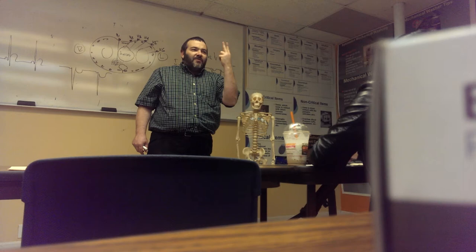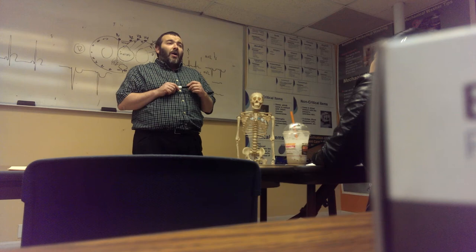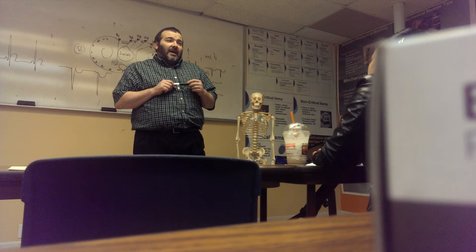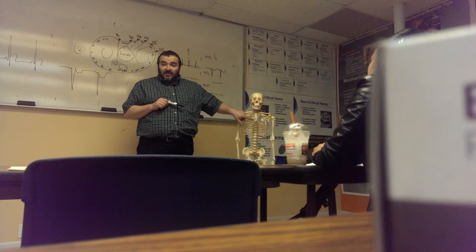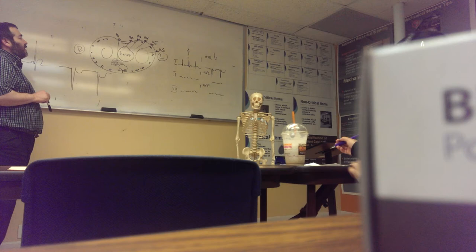You absolutely must study the positions of V1, V2, V3. If I wake you up at 3 o'clock in the morning, after you just had a massive party with alcohol involved, you should still be able to tell me the answers to all my questions. I love to ask people on the test where the stickies go on the chest. You must know where they go. They're in your handouts, they're everywhere. What are they called again? Vector leads. So all together, 12 leads. Does this make some sense?